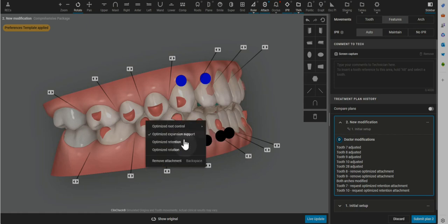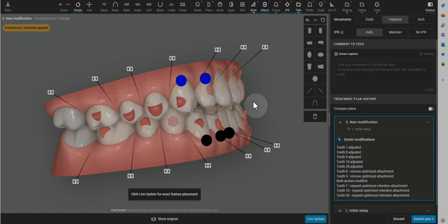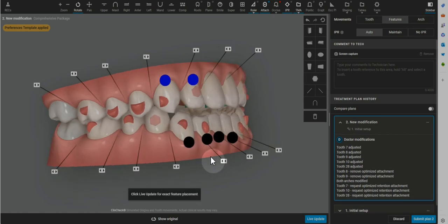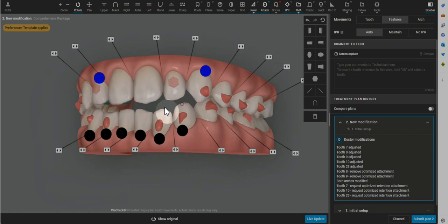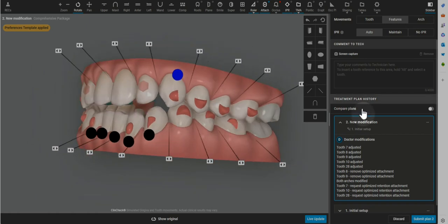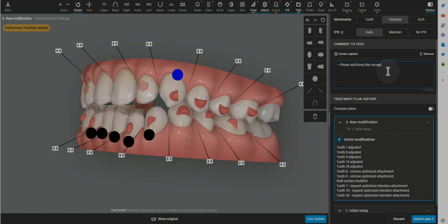And if we can change this to a retention attachment, it just focuses so much more on the anterior intrusion. And here we would just say, please add or keep bite ramps throughout treatment plan starting at one.